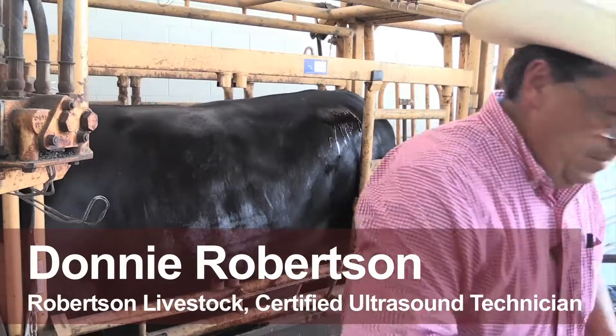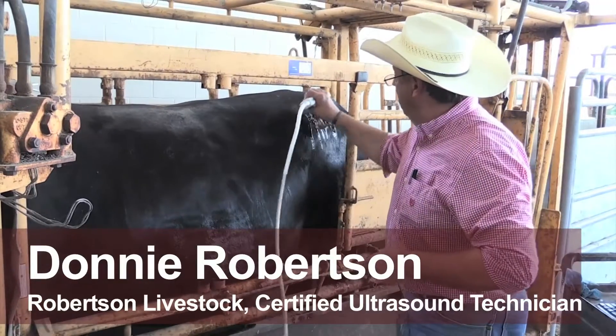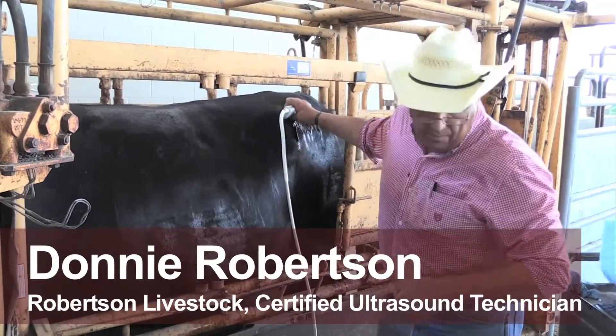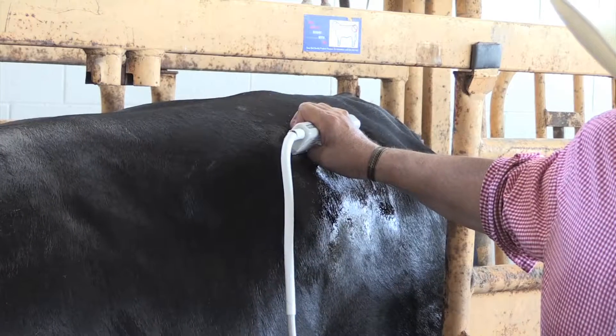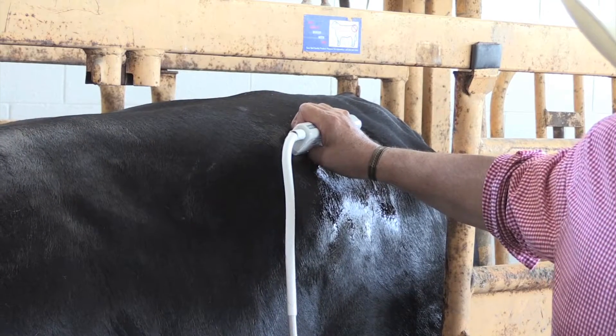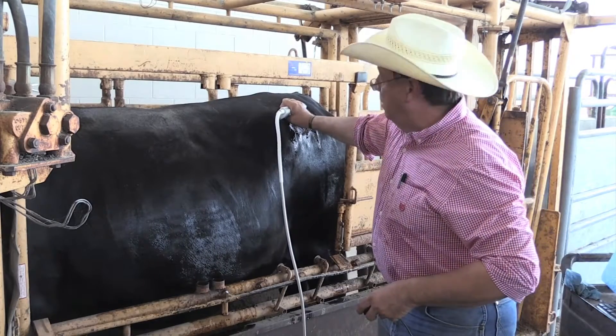I'm doing it on rump fat. Some breeds are part of this, some don't. What we're doing is we're going right to the hip bone and we're going to pivot off that towards the tail head. I'll watch the screen and I'm going to get a good clean image that shows the curvature of the pelvic bone here.